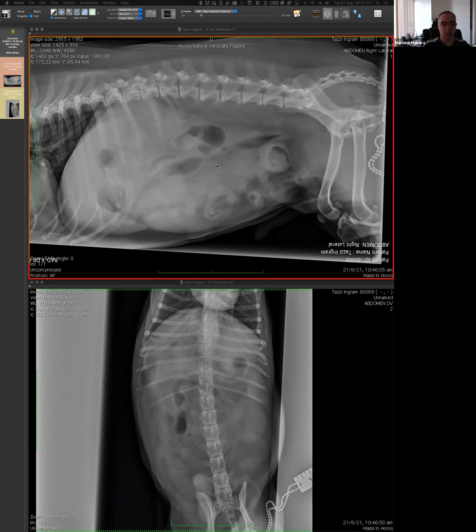So this is somehow an exception to a rule because when we think about obstruction, we think about these two populations, and that's what we want to remember. This one is somehow breaking that rule, but I think there are beautiful features, and I think we picked them up. We picked this up, we connected.